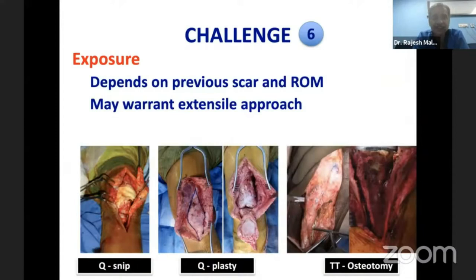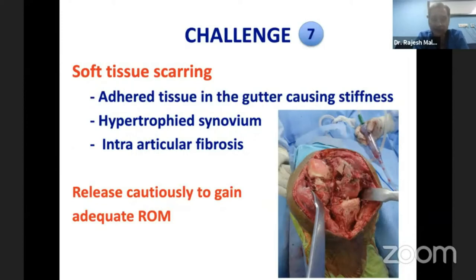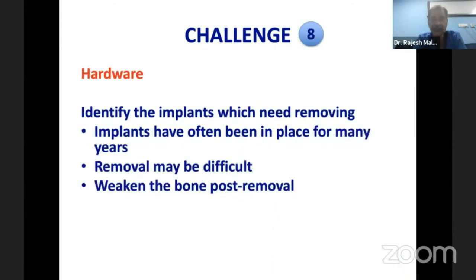The sixth challenge is the exposure. These knees are often stiff and scarred, and exposure depends on the previous scar and range of motion. You may need an extensile approach, a quad snip, a quadricepsplasty, or a tibial tubercle osteotomy depending on the situation. There is extensive soft tissue scarring with adherent tissue in the gutter. Start by debriding the gutter, removing hypertrophic synovium, addressing intra-articular fibrosis, and cautiously releasing adhesions to gradually gain range of motion without fracturing osteoporotic bone or avulsing the tibial tuberosity.